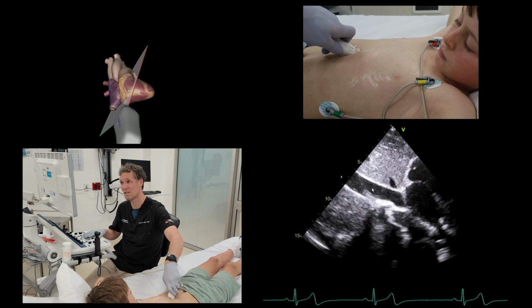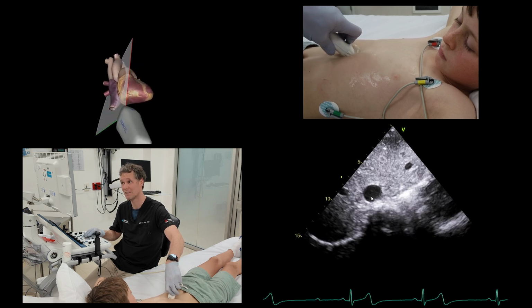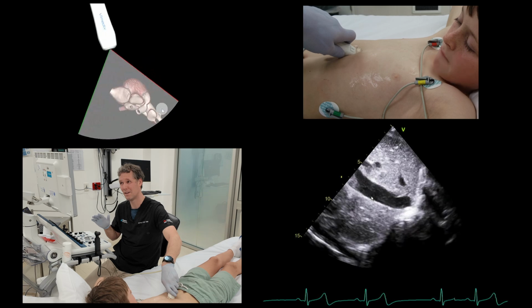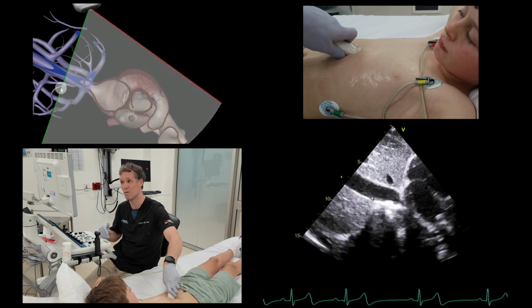This is where you can make measurements either in the long axis, or if I rotate back, you can measure it in the short axis. But with the measurements you make, just make the same measurements every time. And I find that these measurements are probably the most useful for looking for estimations of right atrial pressure rather than fluid responsiveness.